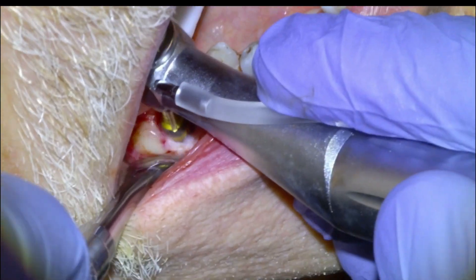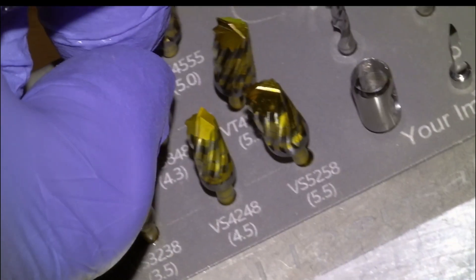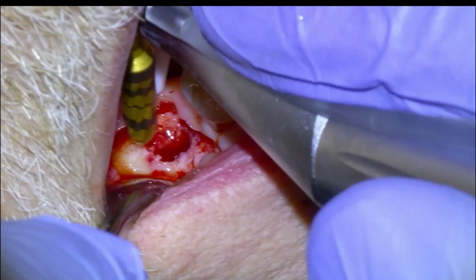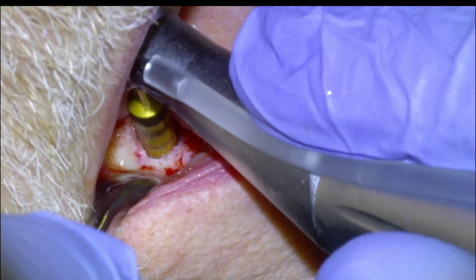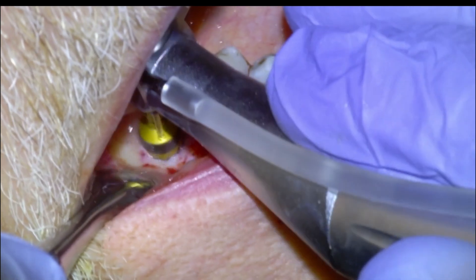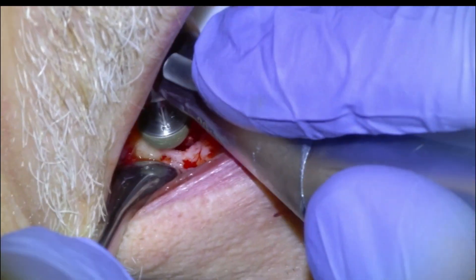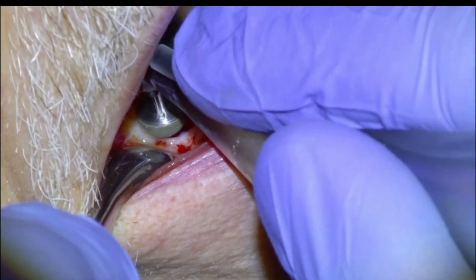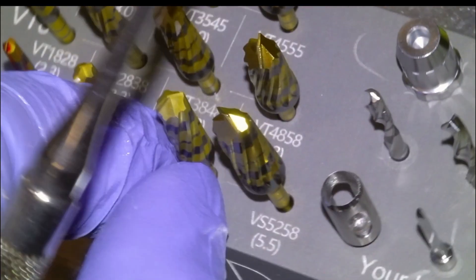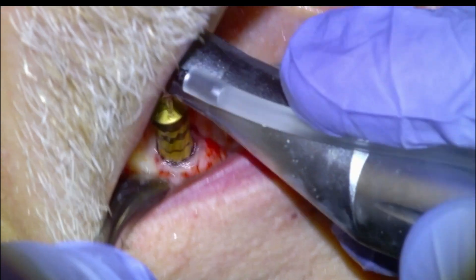Fast forwarding here. Everything's on clockwise motion. I'm going to grab a 4.3 millimeter drill as our second to last. For these ones I'll usually give it a little swish with irrigant before putting it into the osteotomy, just to wet the surface of the drill. We'll take this one to length — since we're placing a 12 millimeter length implant, we'll take the osteotomy down to 13 or 14 millimeters. Once that's done, I'll do a little profiling to get better length measurement and make the cuff of the osteotomy nice and uniform. Then we'll grab the 4.5 millimeter drill and take that down to 13 millimeters. That'll be it for the osteotomy — we'll be ready to place the implant.